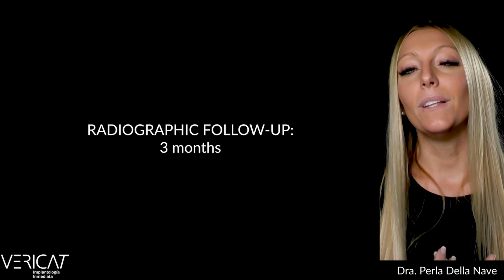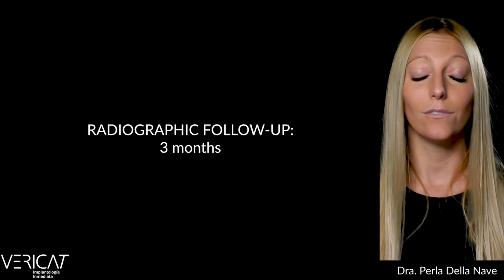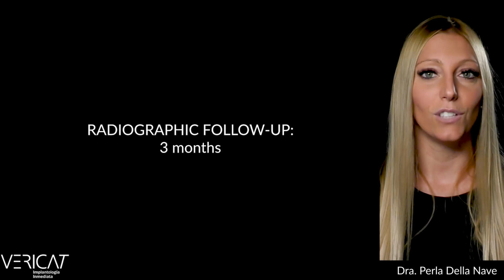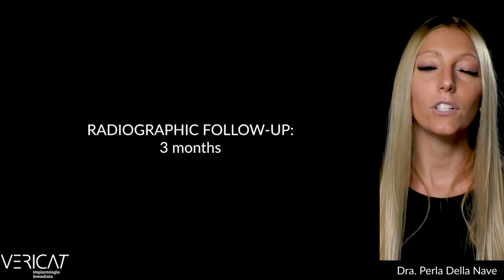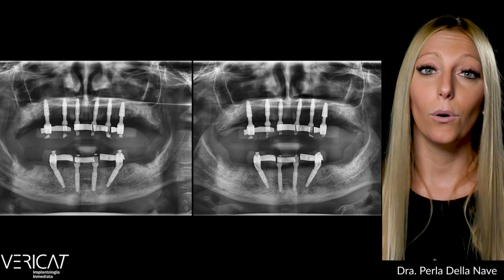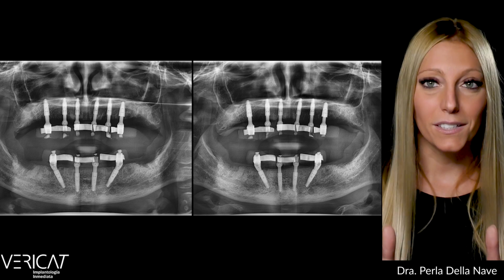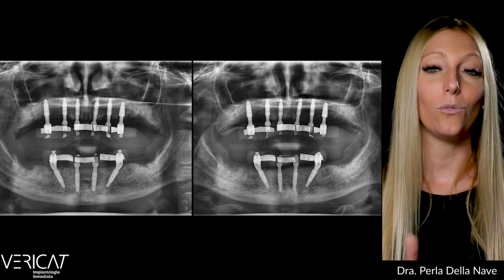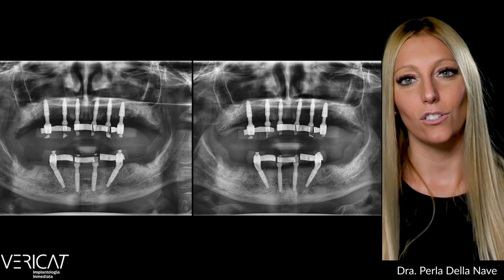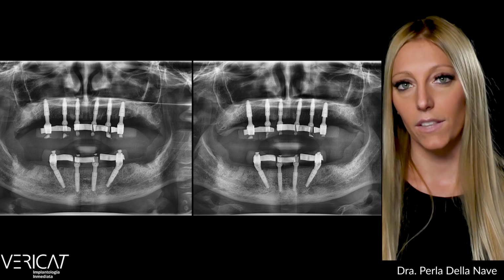But anyhow, I simply invite you to observe the bone level in the way we all do when a patient comes to us for a follow-up visit, and we take a look at the peri-implant bone level to verify its conditions and rule out any kind of complication, right? So, for example, beginning with the 3-month follow-up cases, we can see a full arch rehabilitation of both jaw bones. The socket healing is correct, or better, the portion of the sockets which wasn't removed during surgery through the regularization of the ridge, which is also essential to anticipate post-extraction physiological atrophy. And the bone level remains embedded around each one of these implants.